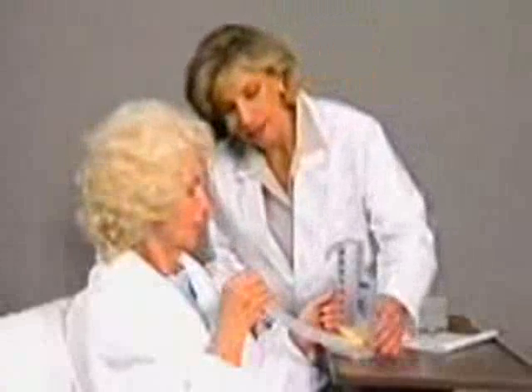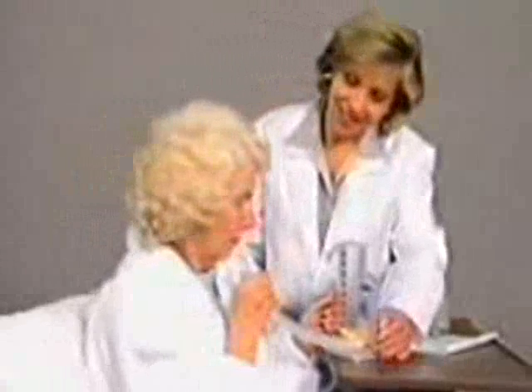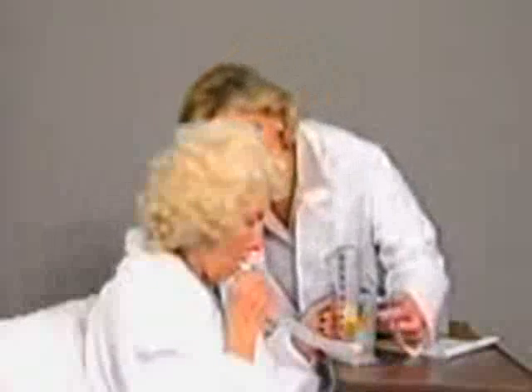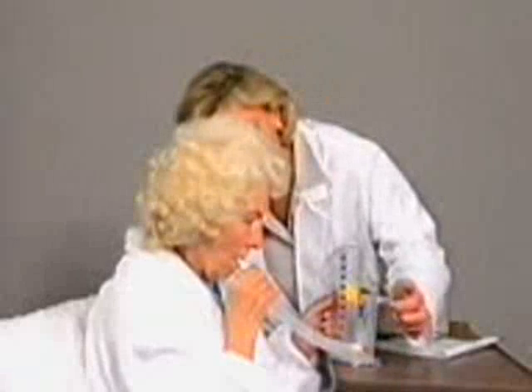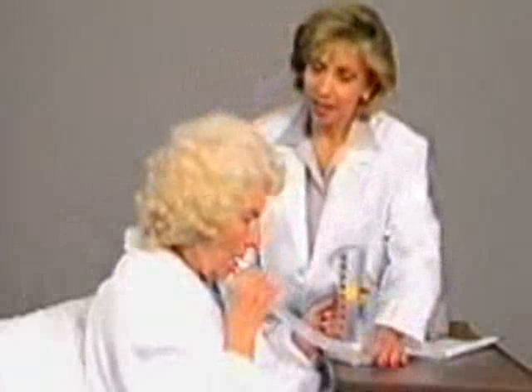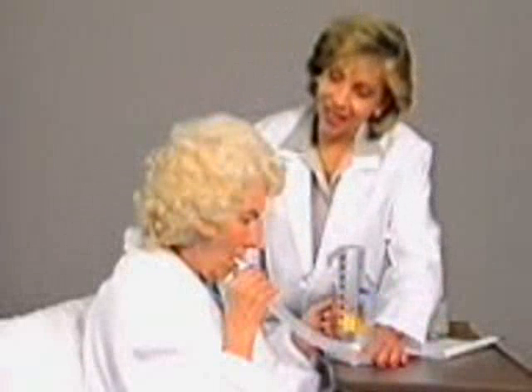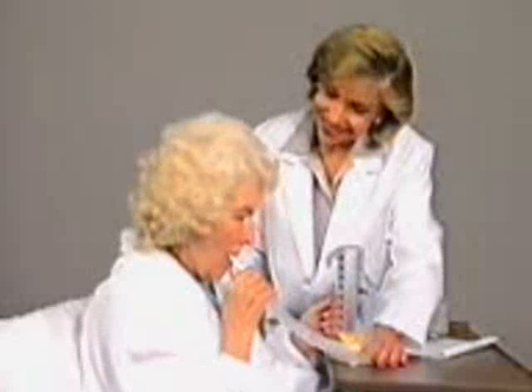Let's review. For the best results from your deep breathing exercises, inhale slowly and deeply over 5-10 seconds. Hold your breath for 6 seconds. Exhale normally. Your clinician will suggest how many deep breaths to take and how often you should use the COACH II incentive spirometer.